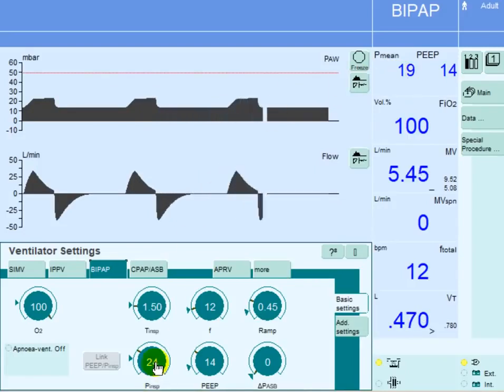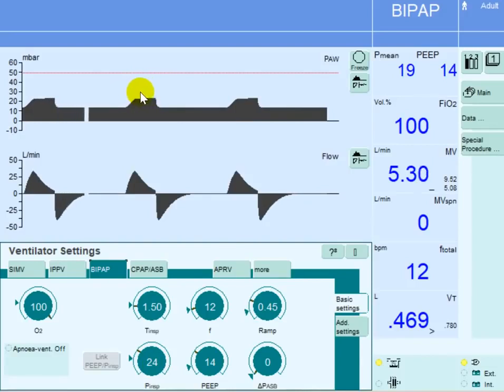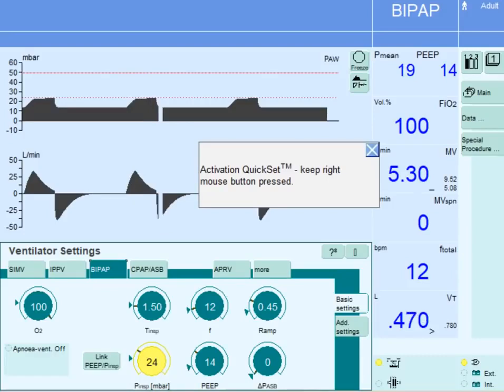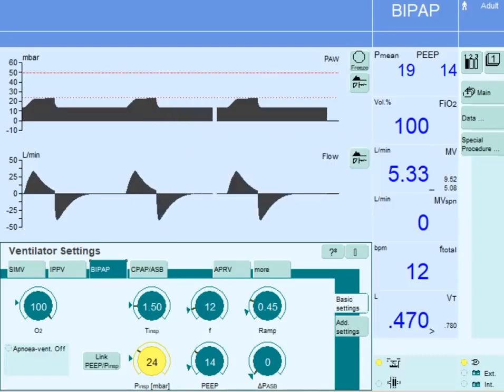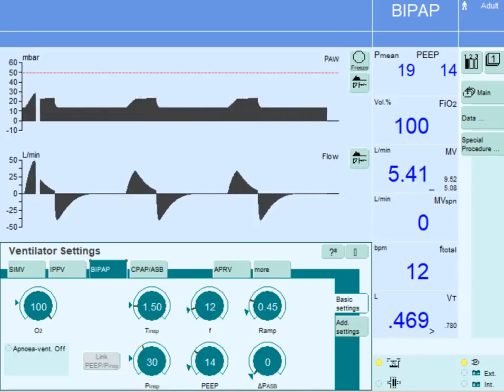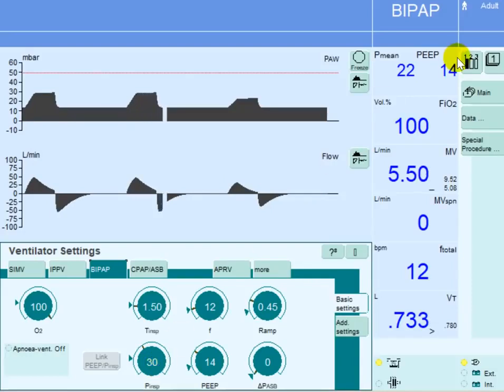The second maneuver to improve mean airway pressure is increasing the inspiratory pressure, adding more black area here in inspiration. We can go up on the inspiratory pressure, but we have a limitation at 30 centimeters of water for lung protection strategy. By going up on the inspiratory pressure, the mean airway pressure increased to 22 centimeters.